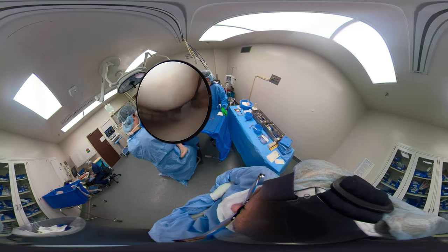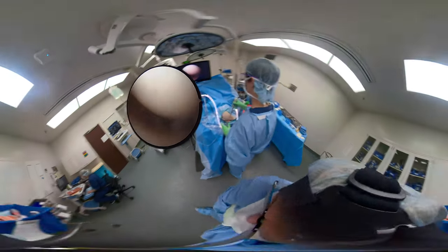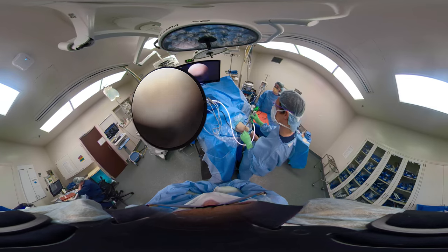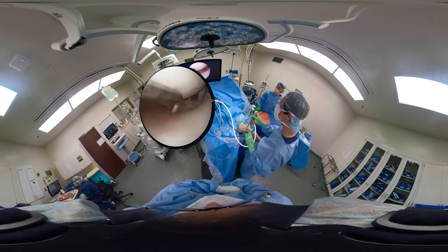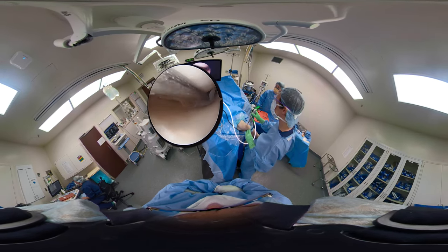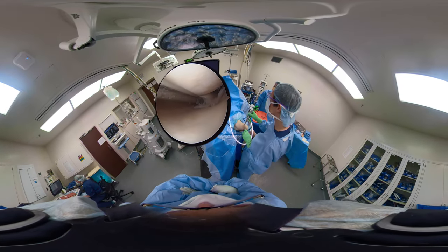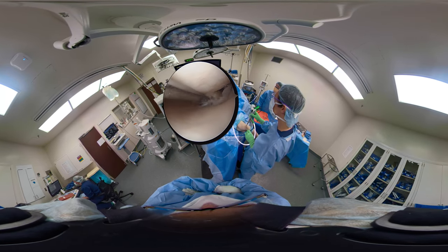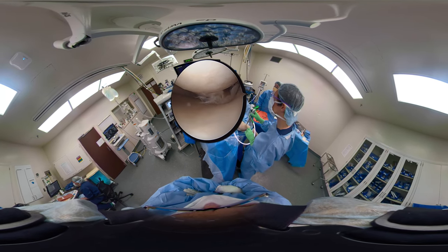Working the light cord, looking in the back — it's a pretty tight knee. That's another important part of putting the leg holder down five finger-breadths above the patella. Now we're probing it. This is a degenerative tibial-sided medial meniscus tear, and a cyst is more mid-medial. It isn't the typical Baker cyst which comes off the back and propagates through the capsule. Probing that, you see how it's all wispy. Fortunately the root is intact.